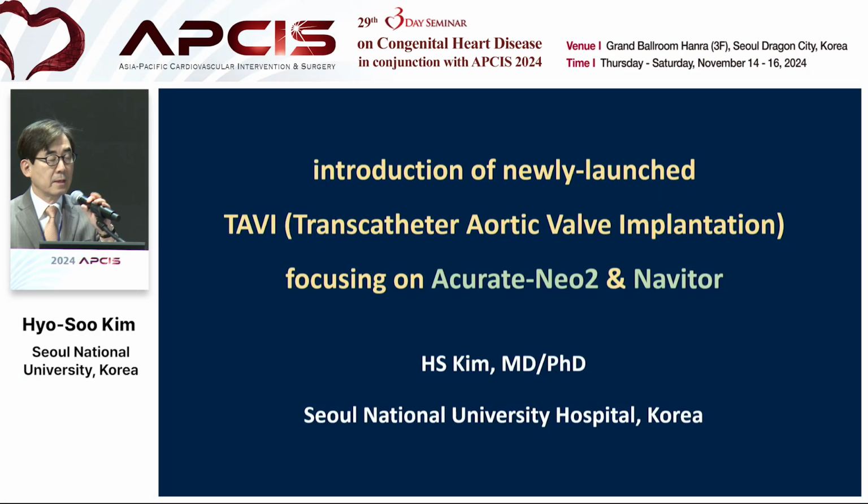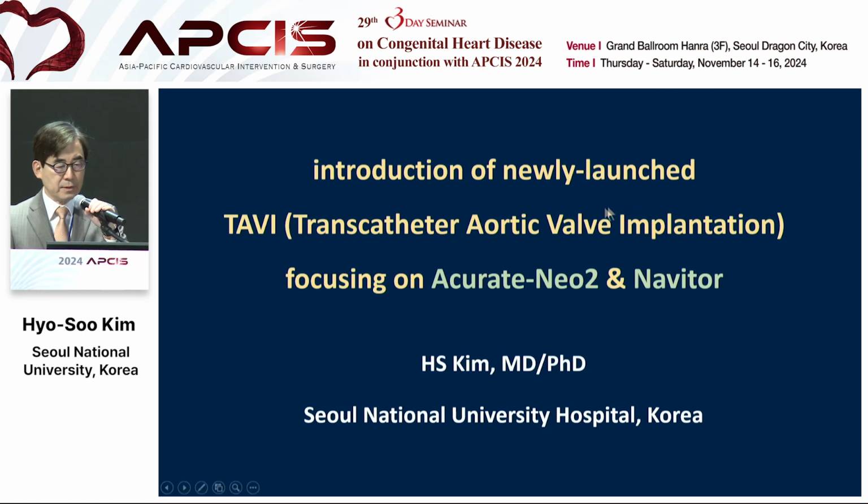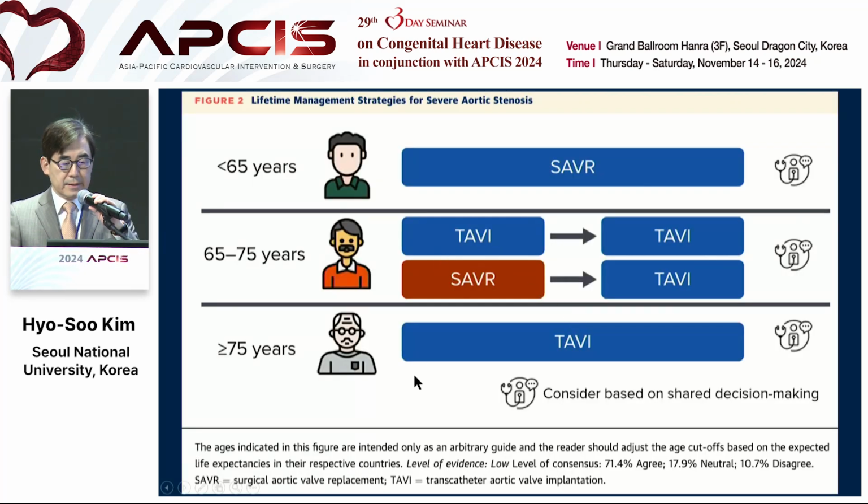Good morning. For the next 15 minutes, I'd like to introduce a newly launched TAVI system in Korea, focusing on AcurateNeo2 and Navitor. These are the American and Asian guidelines in choosing TAVI or SAVR, depending on the age. Above 75 years old, they all agree with TAVI as the first option. Under 65, SAVR is the first option.